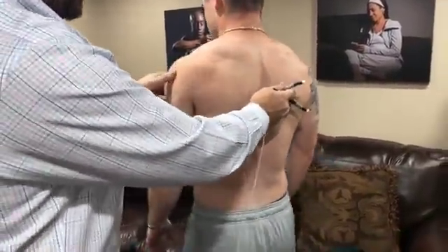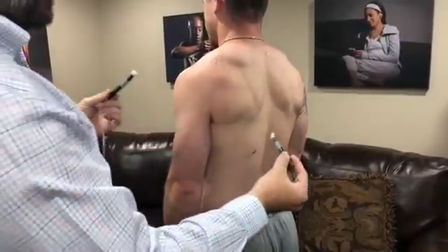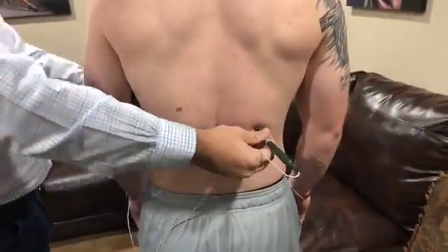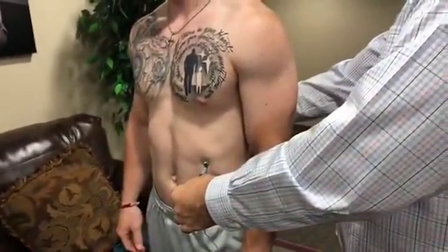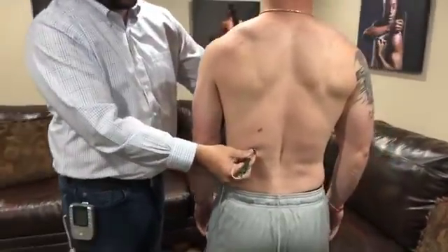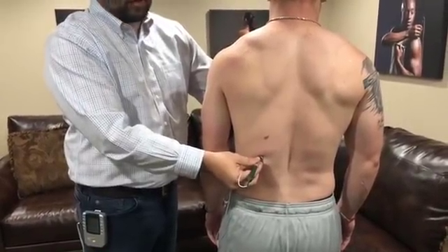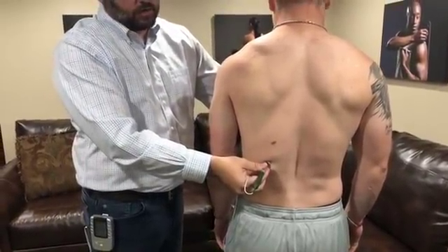The other thing we want to do is an X or small star. What we do here is go on the right side of Travis's back, right where he indicated his pain was, and on the opposite side of his abdomen — going right through the spine. We do this for 10 seconds, and then we're going to switch: left back and right abdomen. So we've made an X pattern at the level where he indicated his pain. Then we're just going to go a vertebra level or an inch or two above it, and then below it also — a total of three X passes.